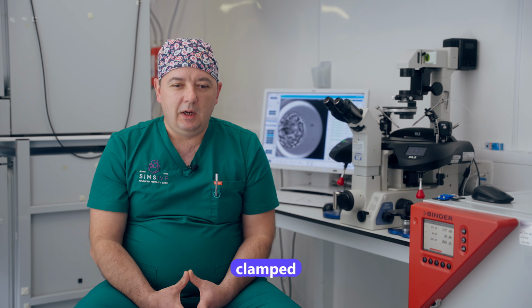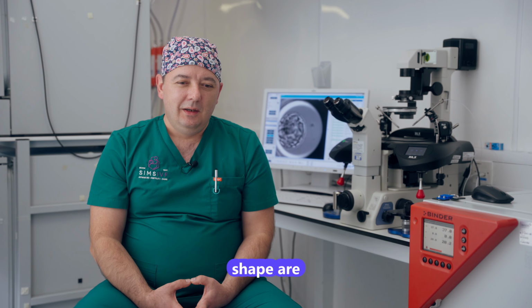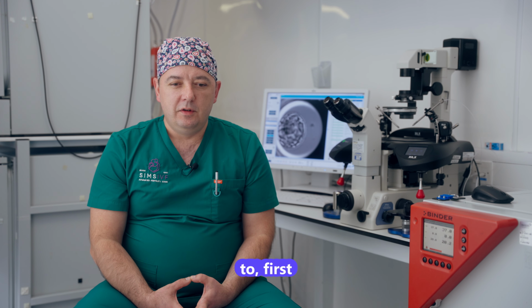At this stage, the embryo already has 2 types of cells. One type of cells forms a small clumped mass of cells called the inner cell mass, from which eventually the baby will be formed. And the outer cells, which form something like a globe shape, are called the trophectoderm cells. Those are responsible, first of all, for signaling the implantation and then for forming the embryonic parts of the placenta. So when we're looking at the blastocyst, this is what we look at.